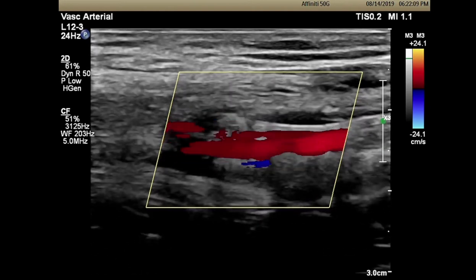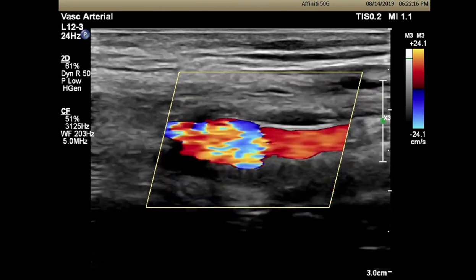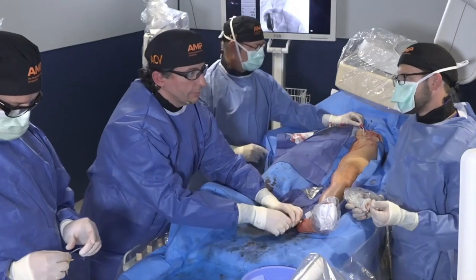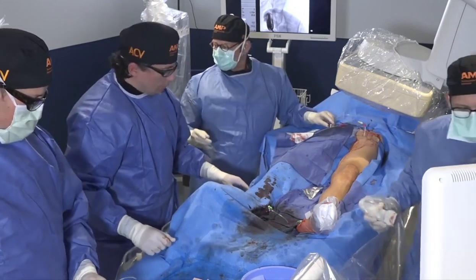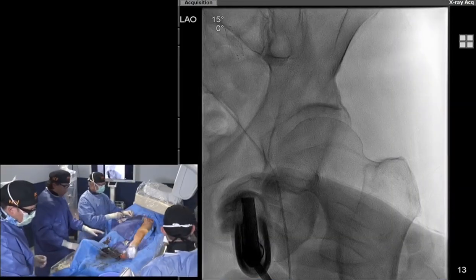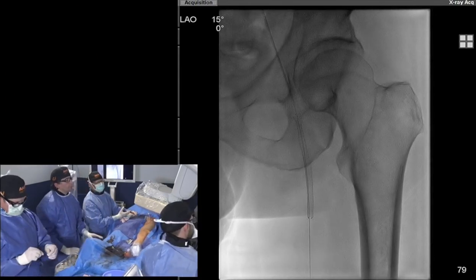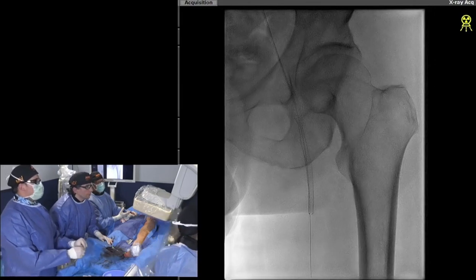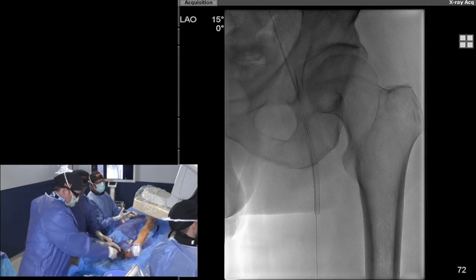Well, with that stent being the size it is, I don't think there's any real risk of hurting the profunda. Let's take a picture before we post-dilate with the Stellar X. The Stellar X is going on top of the stent. Wait — the data supports using the Stellar X first, then the stent. But you can use the Stellar X in a distal area. Actually, there's the Penelux trial, which says drug-coated balloons after bare metal stent implantation is an alternative treatment to drug-coated stents in high bleeding risk patients.